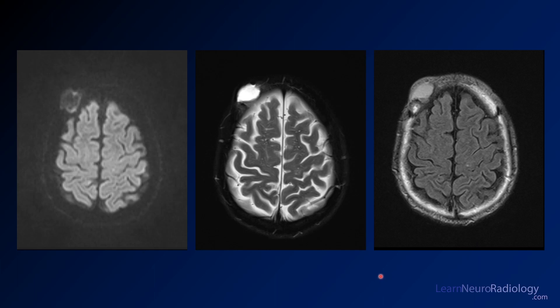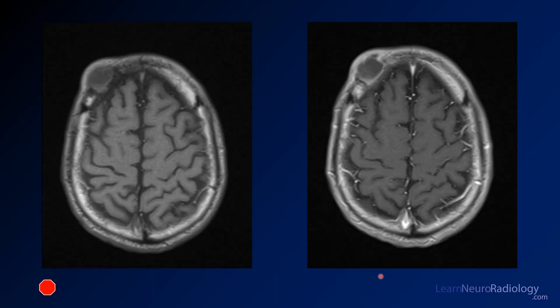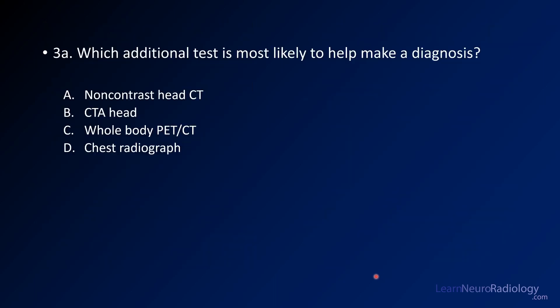I'm going to use this to drill down to see if you can find the abnormality. These are pre and post contrast images, so take a look at that same abnormality. The question here is: which additional test is most likely to help you make a diagnosis? Do you want a non-contrast head CT, CT angiogram, a whole body PET-CT, or chest radiograph?